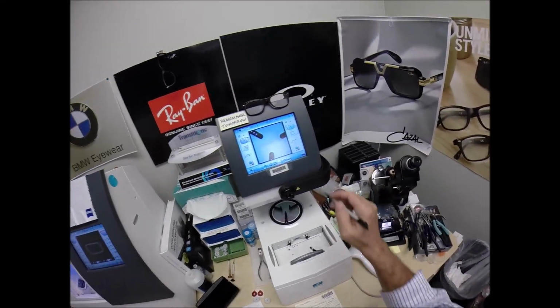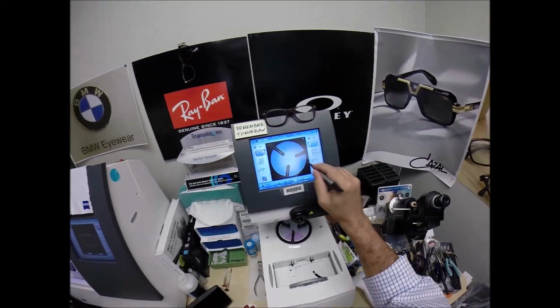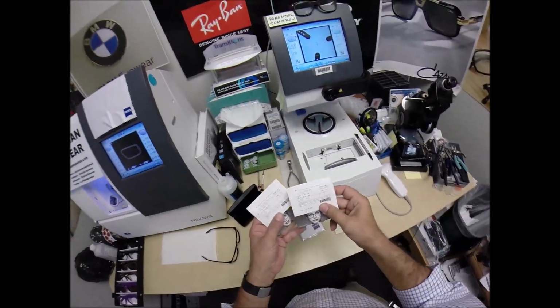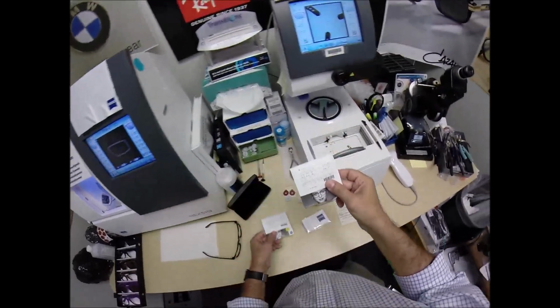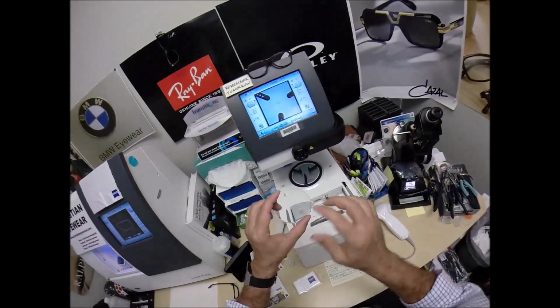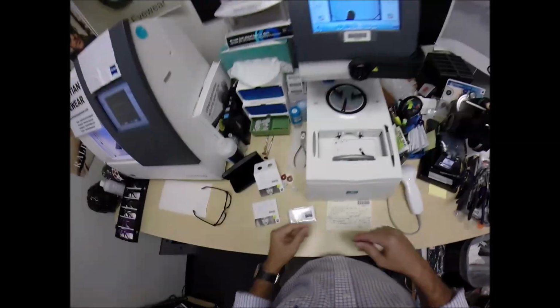So this is the shape that I'll be cutting, only larger. So let me go ahead and magnify that back up. Now I'm using the Zeiss Light D digital freeform progressive lens. I'm over 40 years old, so I need the invisible bifocal, of which I have these here. Take the lens out of the first packet. Now I have 3 dots on there that orients it. It tells me that it's going in there correctly.